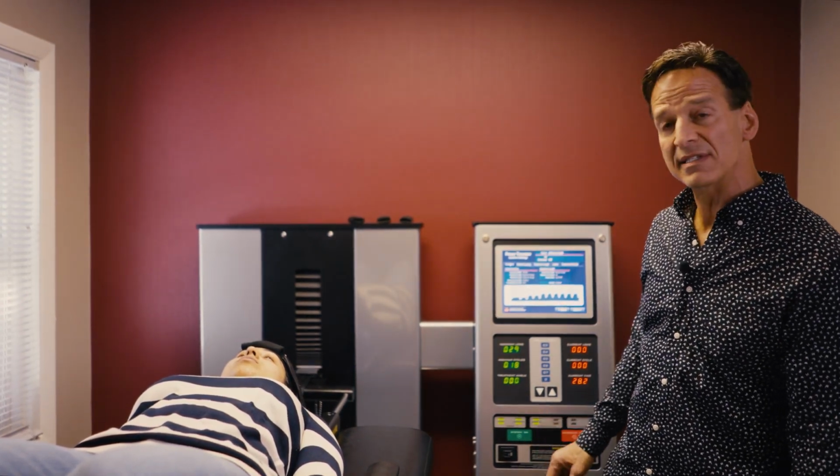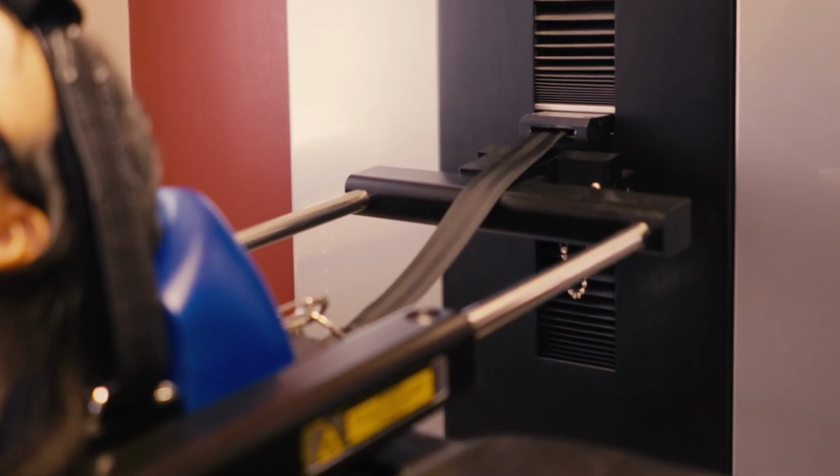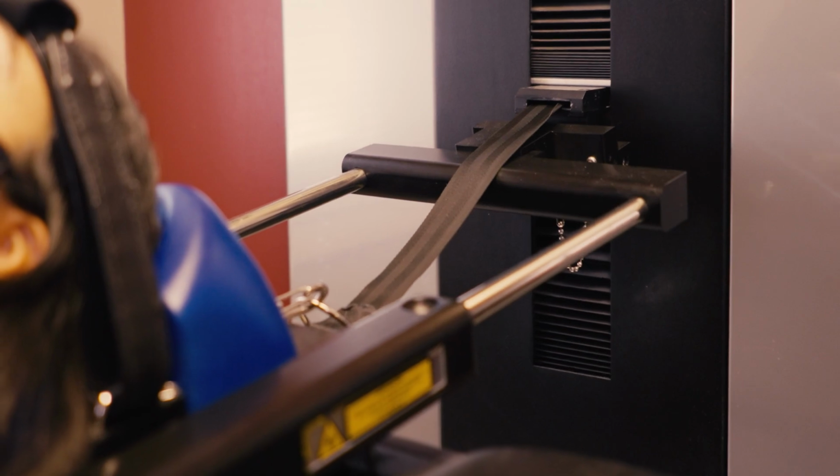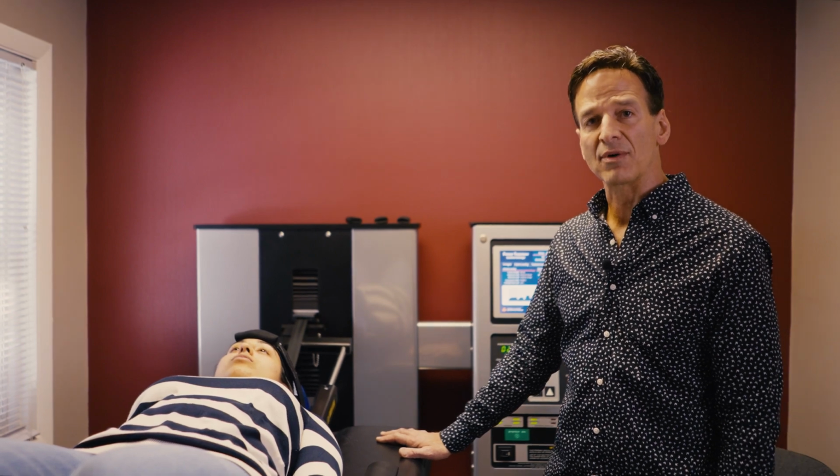So on our patient here today, we're going to work on the C6, and you can see it creates an angle to target that specific disc. You're on the machine for approximately 30 minutes, and again, it's very gentle pulling. Often patients will fall asleep while they're on the machine.